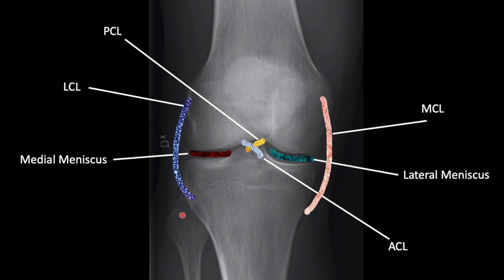On this radiograph you can see the important ligaments. There are two important ligaments sitting in the middle and crossing each other - the cruciate ligaments: the anterior cruciate ligament (ACL) and posterior cruciate ligament (PCL). On the sides you have the collateral ligaments: the medial collateral ligament (MCL) and the lateral collateral ligament (LCL). In between the femur and the tibia, you have two menisci that work like cushions - the medial meniscus and the lateral meniscus.